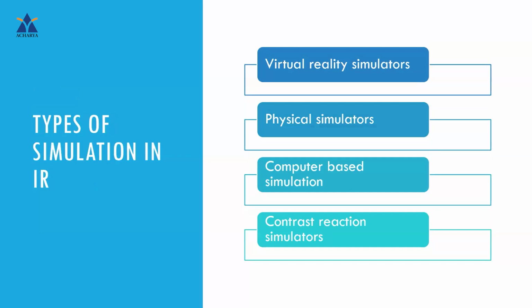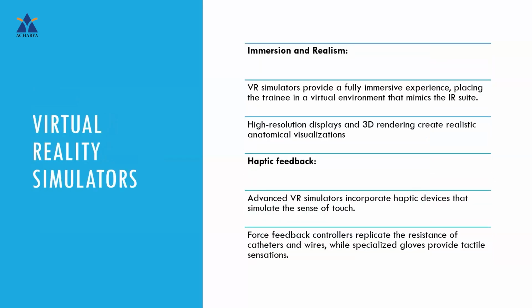So basically we have 4 types. We have virtual reality simulators, physical simulators, computer-based simulation, and contrast reaction simulators. First is virtual reality simulators. It will give a completely immersive and realistic experience.